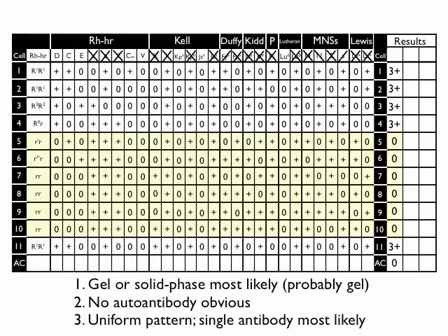So you've got many antigens that have been ruled out as the target of your antibody, and you've got many that haven't been already. So what most people will do is they'll go through and they'll put circles around everything that has not been ruled out. More on that in just a moment.